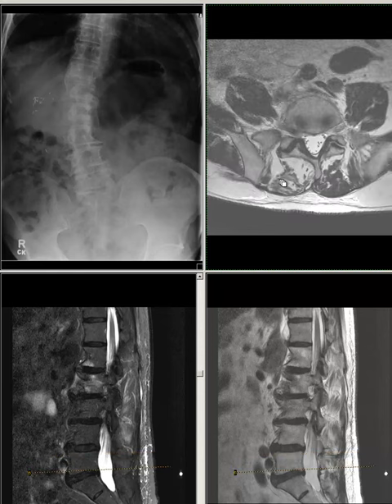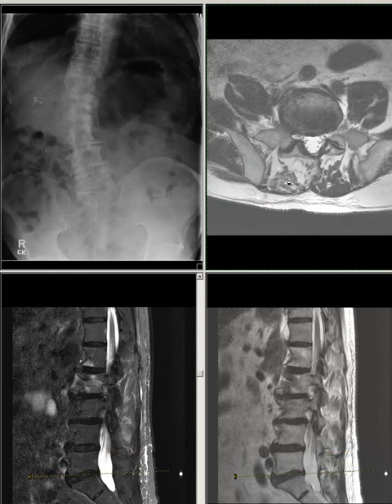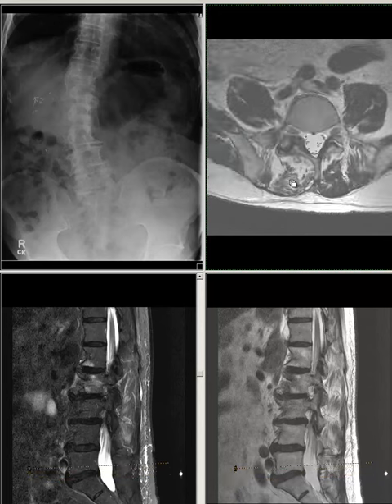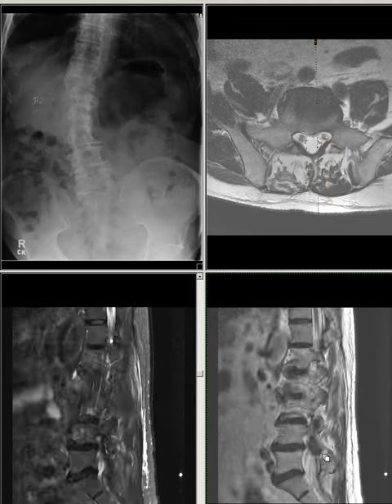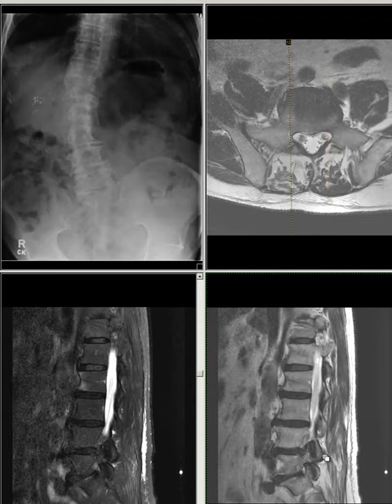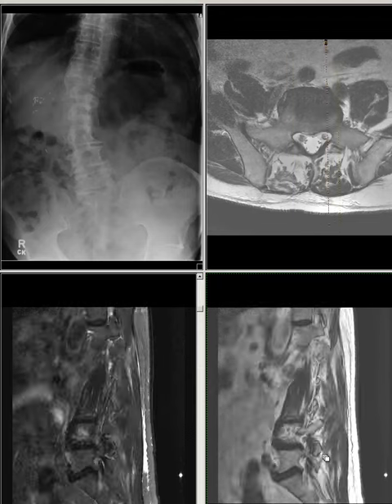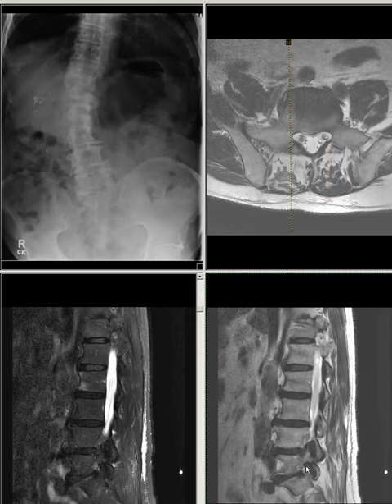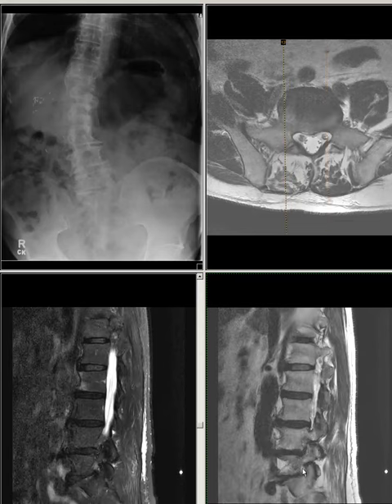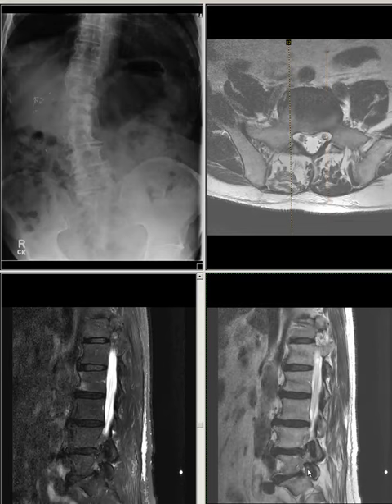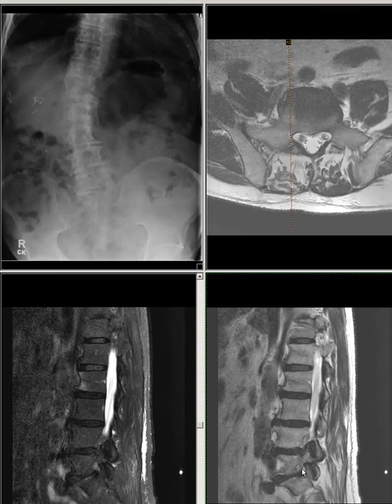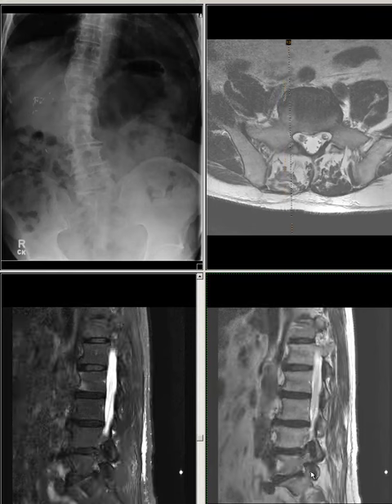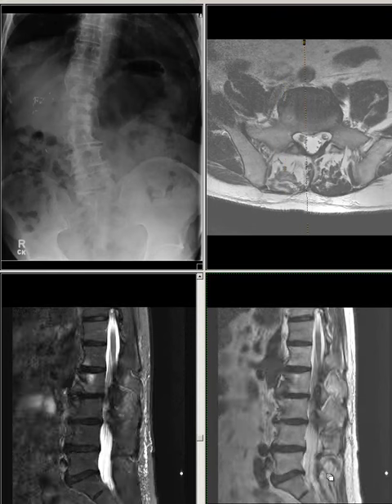L5-S1: There is disc desiccation and broad-based disc bulge. Facet joint arthropathy bilaterally noted. There is mild left-side neuroforaminal stenosis and mild right-side neuroforaminal stenosis without complete effacement of neuroforaminal fat. Slight compression on the right L5 nerve root is possible.